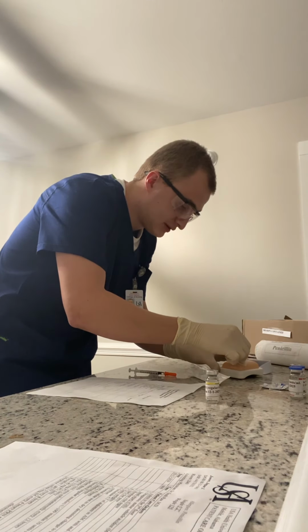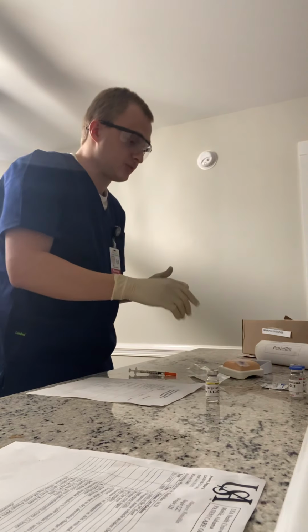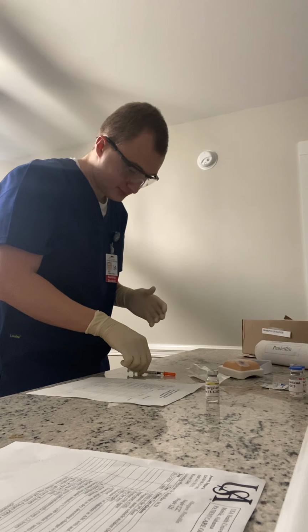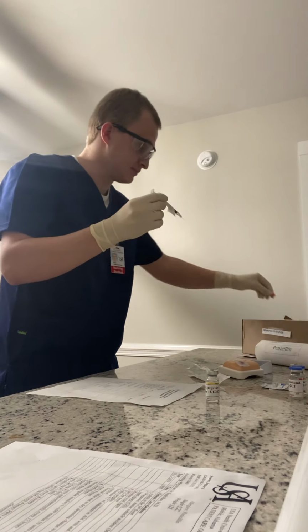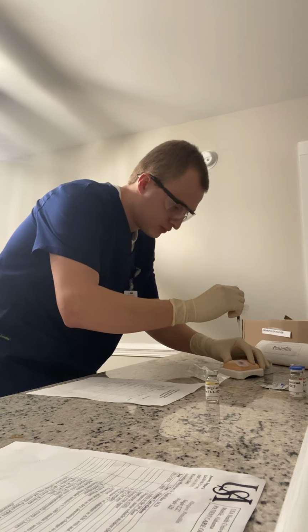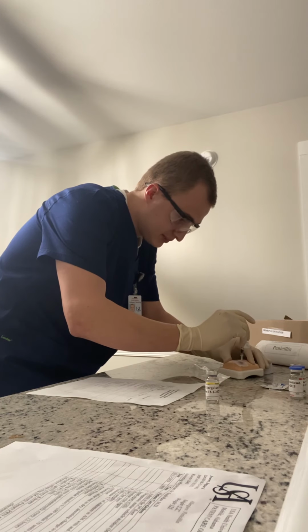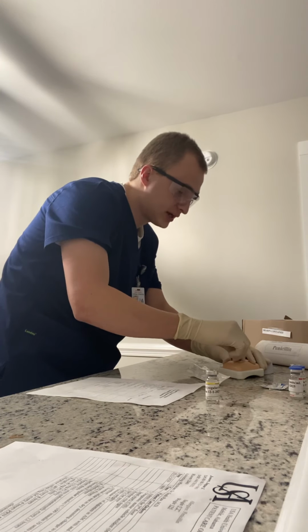And I will leave this clean alcohol pad on, showing where I will be performing the administration. And I will remove the cap and dispose in the sharps container. And as I am pinching the skin, I will go at a 90-degree angle and slowly administer the medication, immediately discarding the cap in the sharps container and applying pressure to the wound.